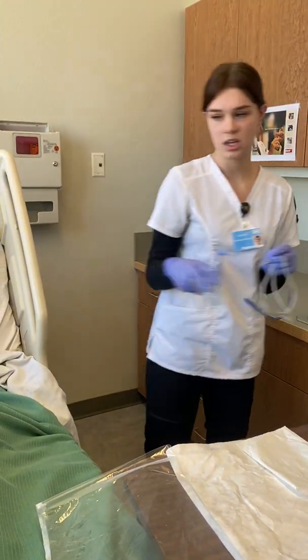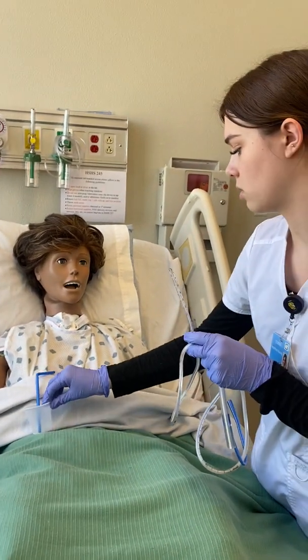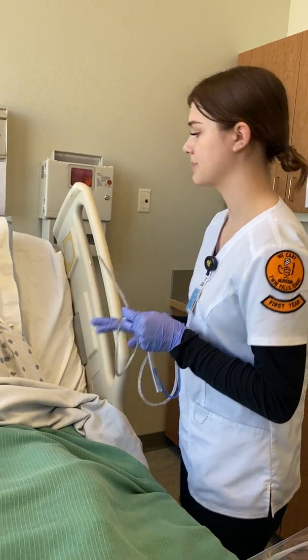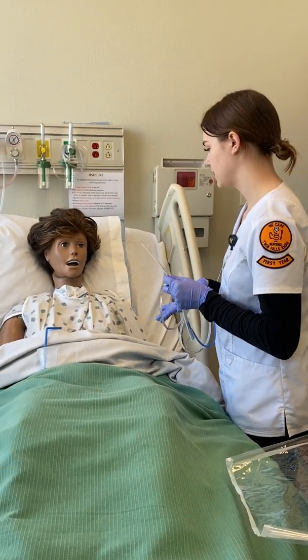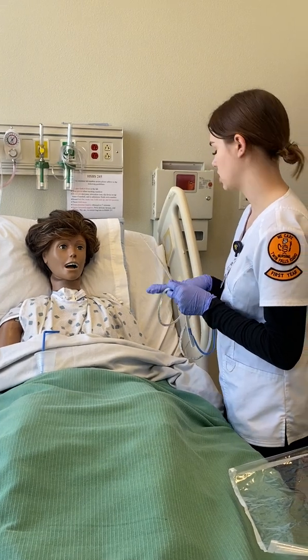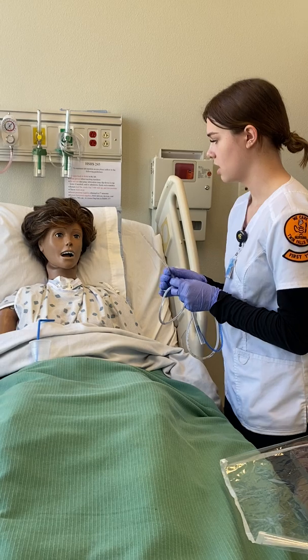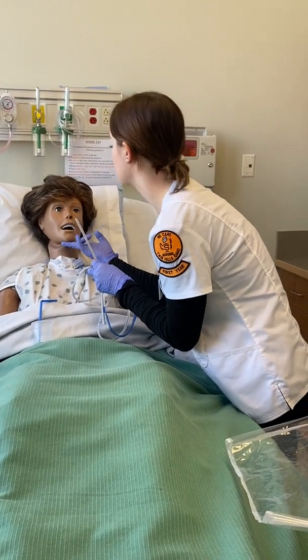All right, I'm gonna give you this cup of water throughout the procedure. Just have you hold it in your right hand. And we're just gonna have you take some sips while I'm doing the insertion. It'll just make it a little bit easier as it goes down, okay? And we're just gonna do it really quickly. Do you have any questions before we get started? No? All right. So I'm gonna go ahead and have you just look up for me.